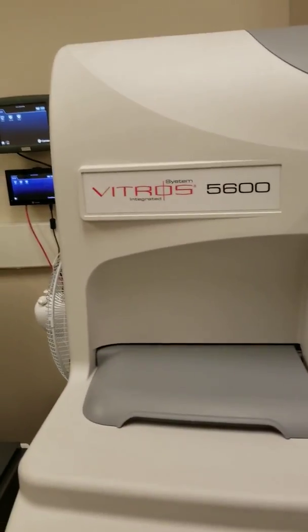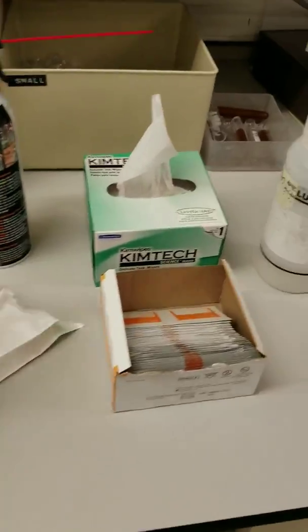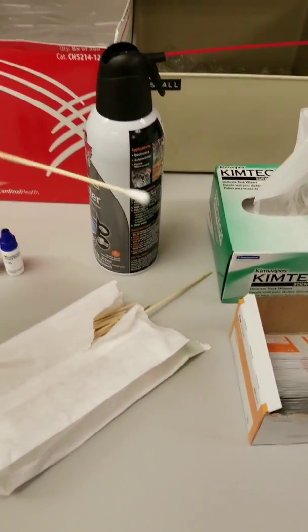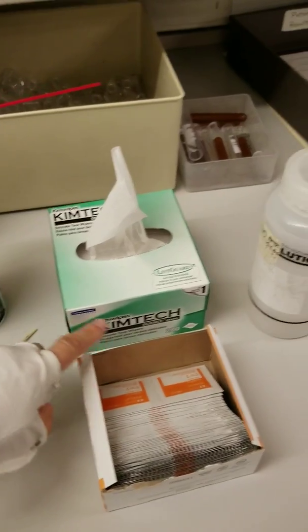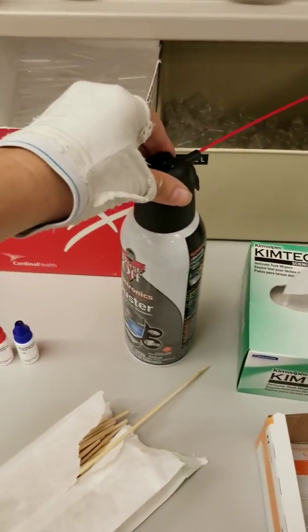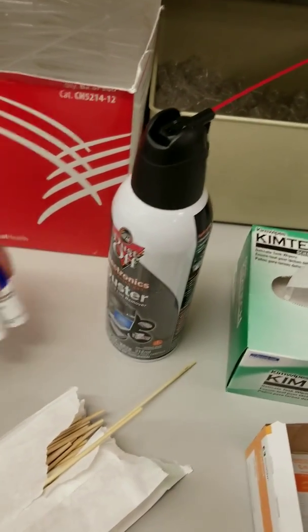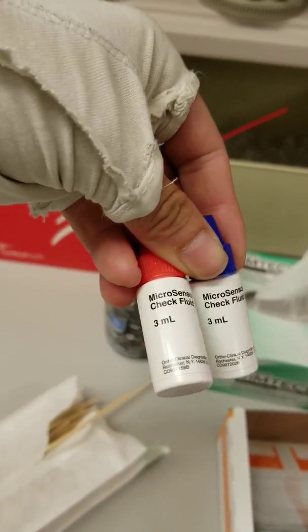Hi! Today I'm going to show you how to do the weekly maintenance on the Vitros 5600. The materials you will need are swabs, alcohol pads, kim wipes, deionized water, a can of air, and your micro-sensor check fluids 1 and 2.